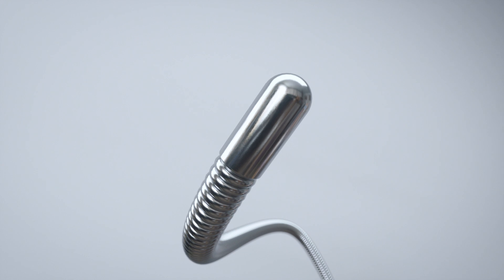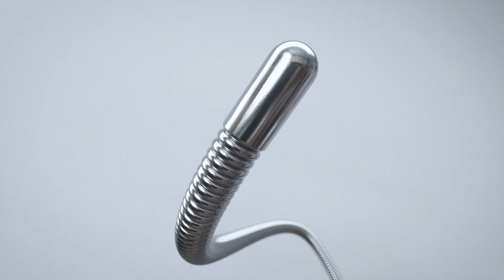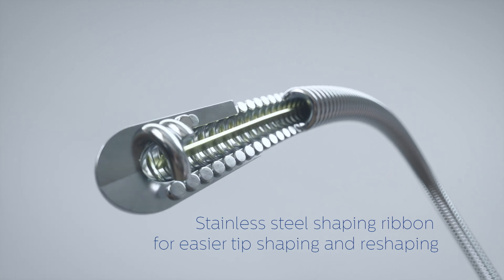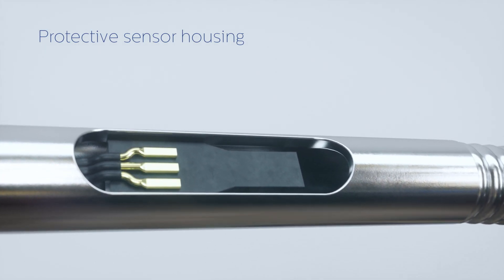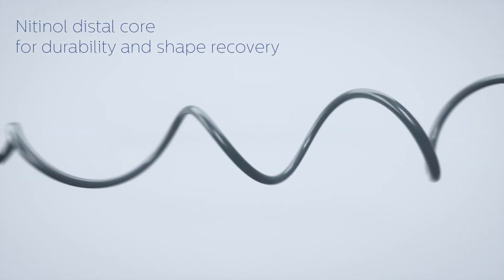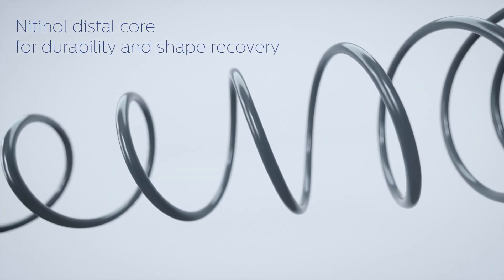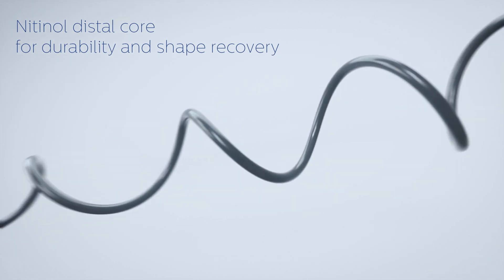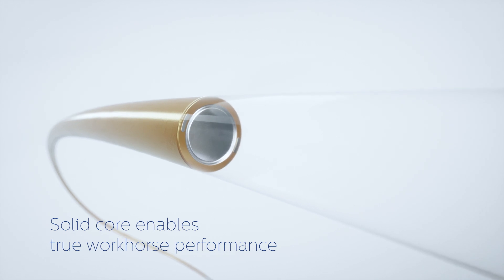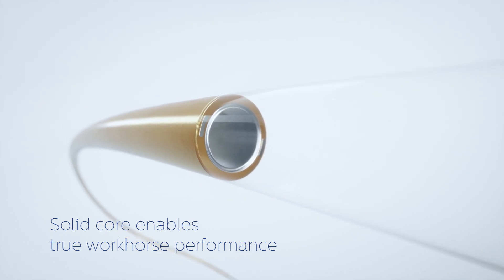OmniWire has a new design from tip to tail. The shaping ribbon allows for easy tip shaping. There is a new, more protective sensor housing. The new Nitinol Distal Core provides durability and shape recovery. The innovative, solid proximal core enables true workhorse feel and performance.